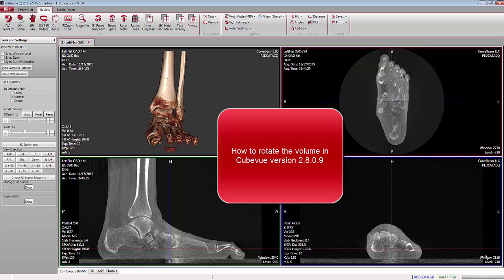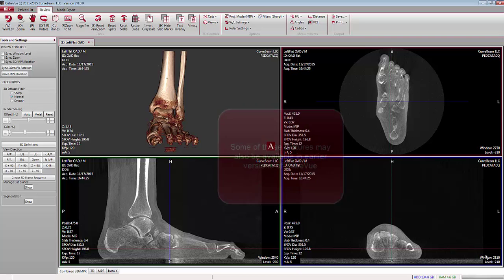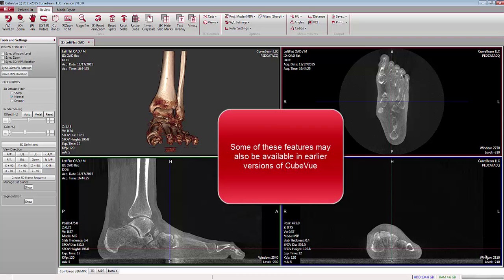This tutorial demonstrates how to rotate the volume and the corresponding images in CubeView version 2.8.0.9. Some of these features may also be available in earlier versions of CubeView.